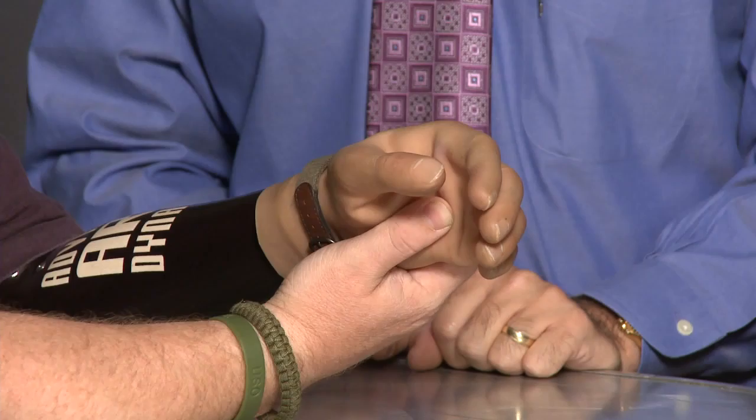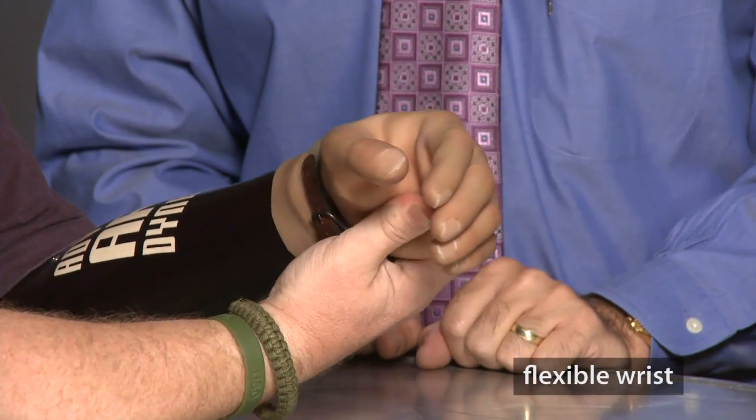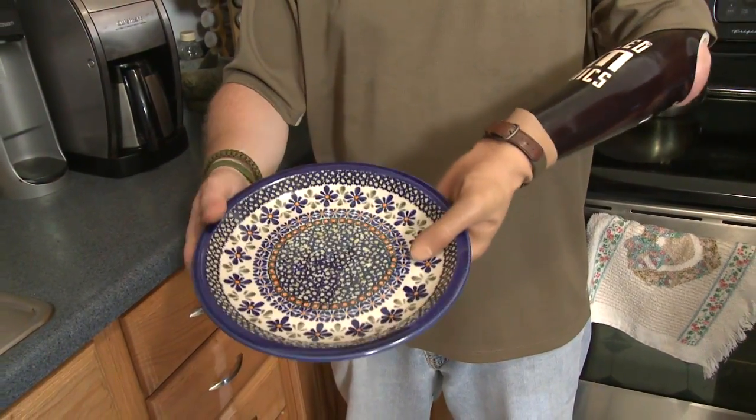Ethan, you've had the opportunity to use lots of different hands. Can you tell me what you think is unique about the Michelangelo hand? I like the robustness of the Michelangelo hand, and I also like the flexible wrist that is incorporated in it. I also enjoy the fact that it just makes things a lot easier.